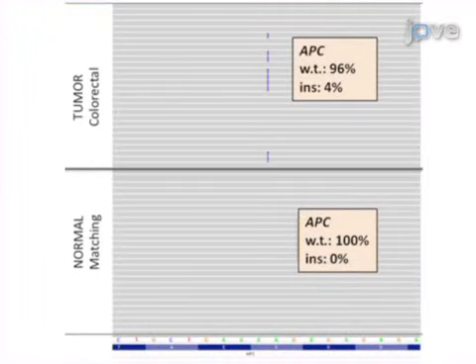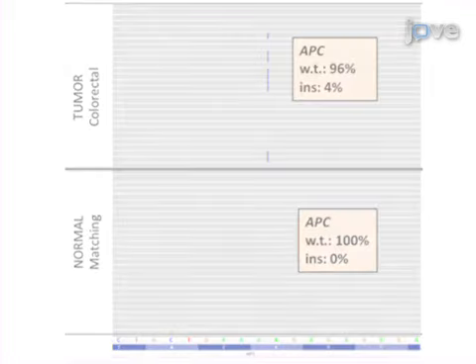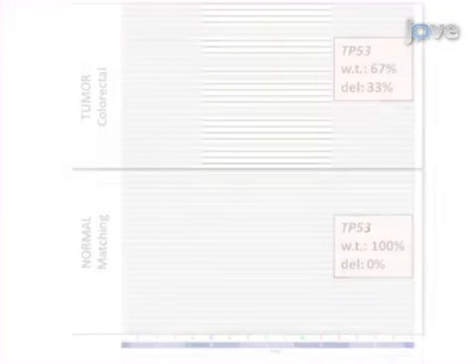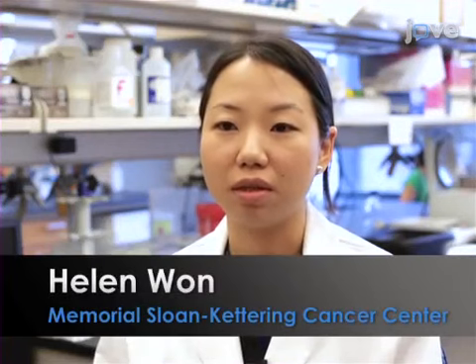For the 279 targeted genes, this procedure can reveal sequence mutations, small insertions, small deletions, copy number alterations, and select structural alterations. So the main advantages of this technique over existing methods are that it allows one to investigate entire exons for both the common and rare mutations, as well as identify additional genomic alterations such as copy number losses and gains, and attain greater sensitivity in heterogeneous samples.